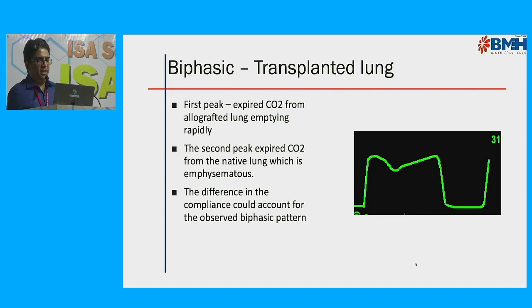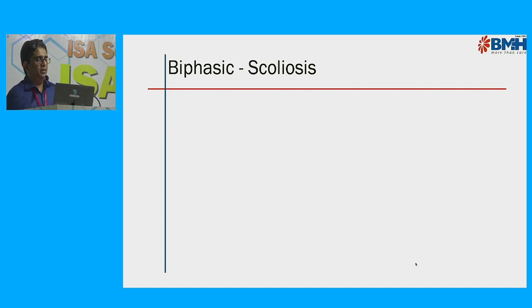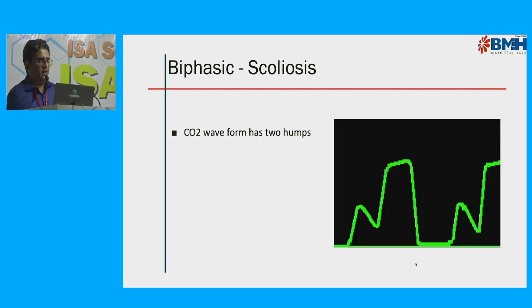Can you say any other conditions where you see a biphasic pattern? Scoliosis. Very good, excellent. Scoliosis. This is another scenario. It has got two humps, kyphoscoliosis.